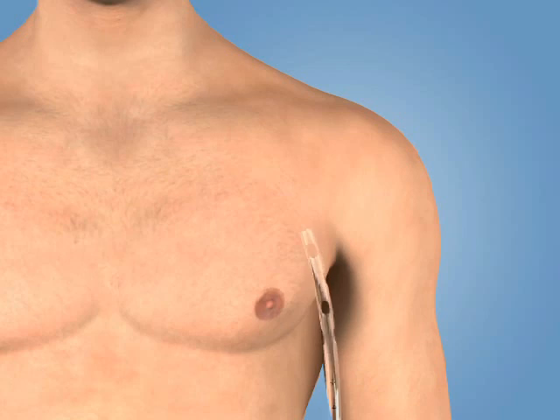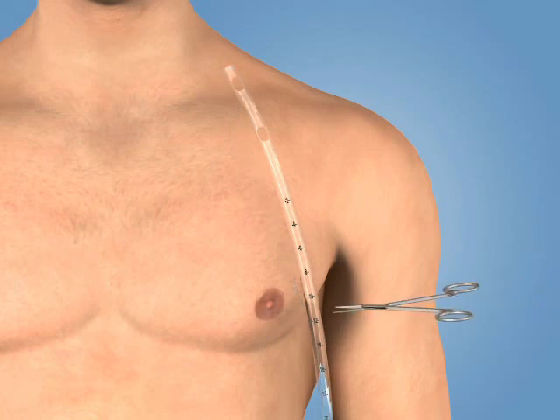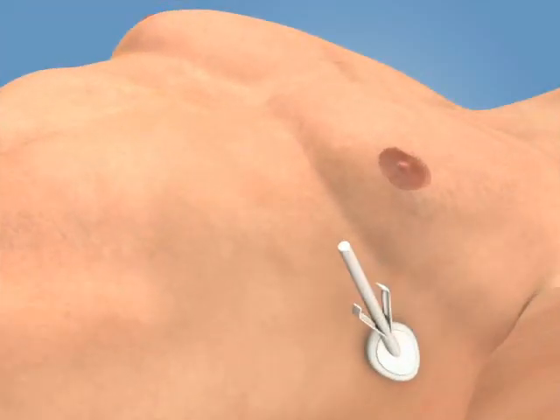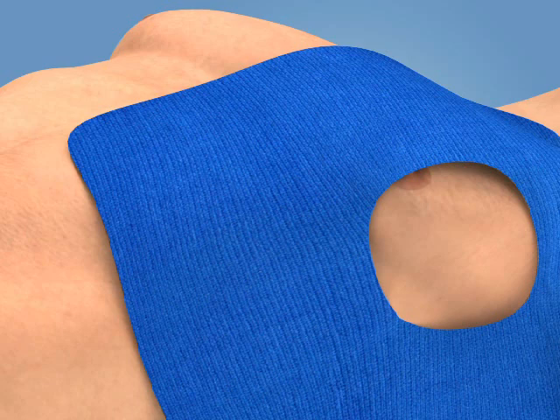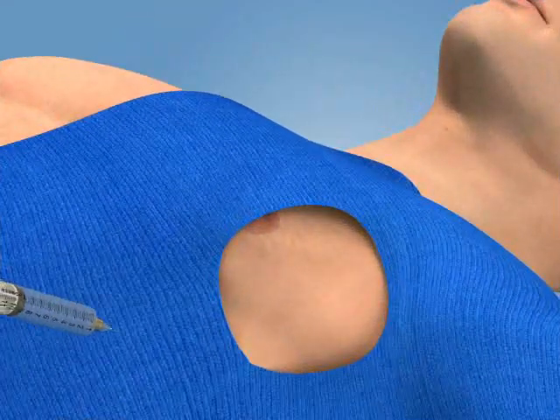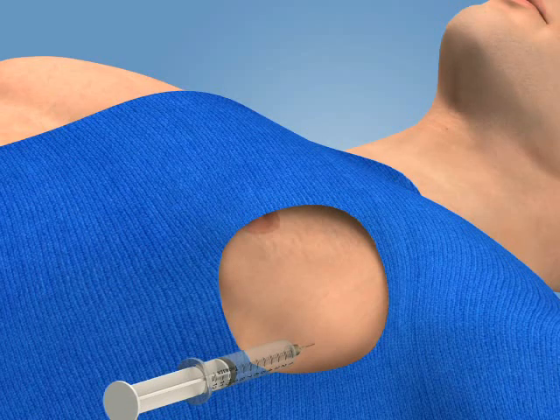Before insertion, hold the tube beside the chest wall with its tip at the level of the clavicle. This estimates the distance the tube should be advanced from the incision site to the apex of the lung. You may place a clamp on the tube to mark the appropriate insertion distance. Next, prepare the area with antiseptic solution and apply a sterile drape. Using a 25-gauge needle, raise a wheal of local anesthetic over the selected rib.